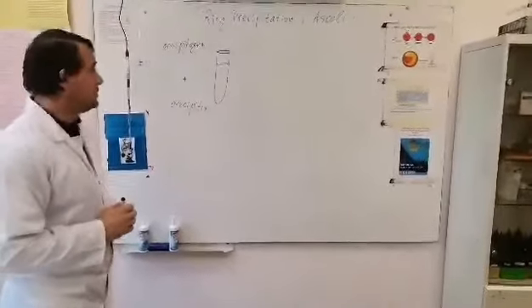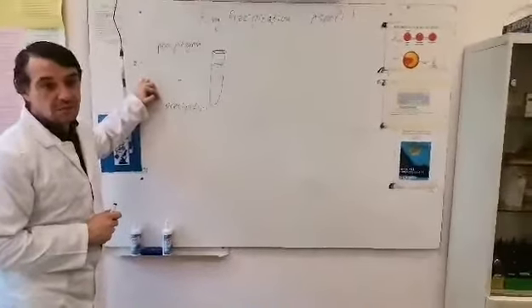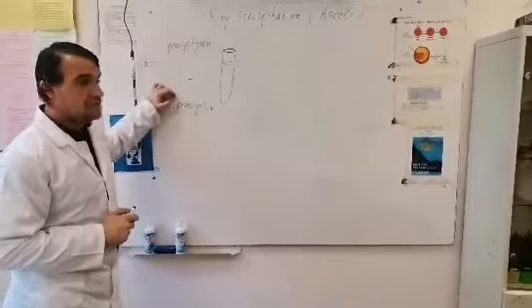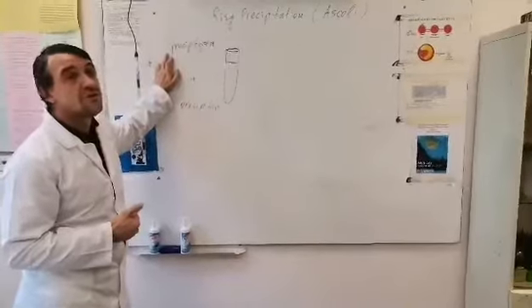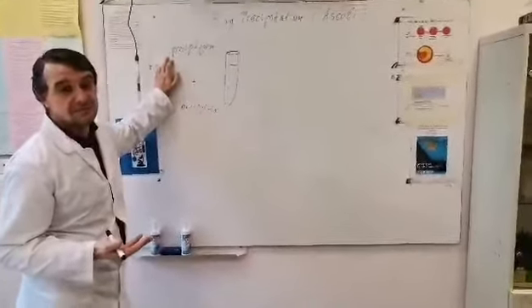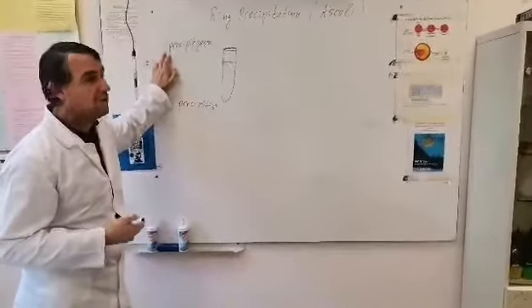Now, what's the principle? We need to mix a serum which contains antibodies, like precipitins, which is usually our reagent, and we search for antigens in a clinical specimen, let's say in a type of tissue or a type of organ, whatever.